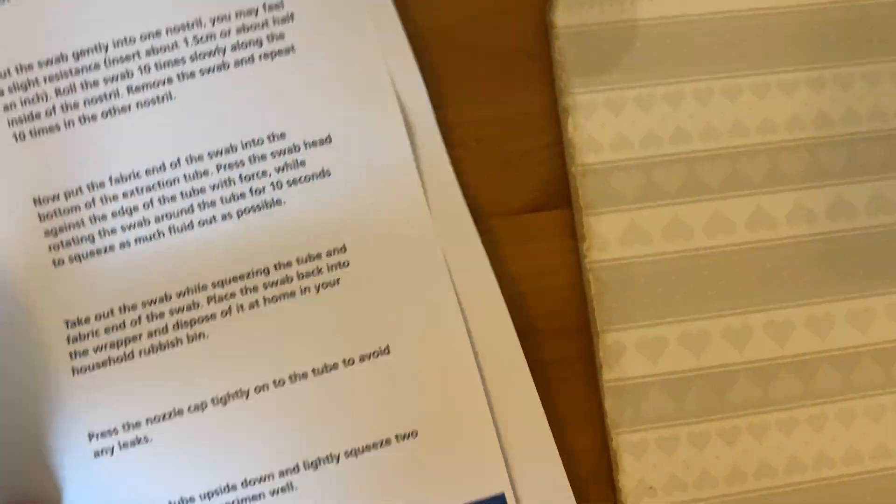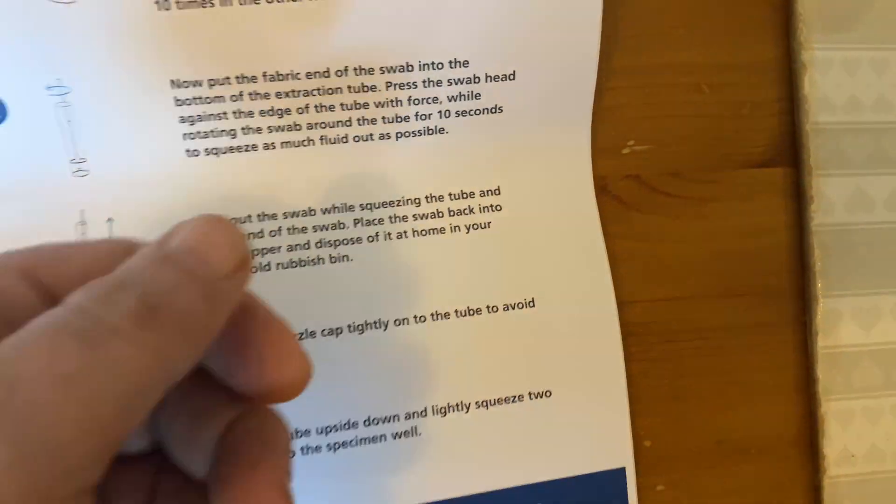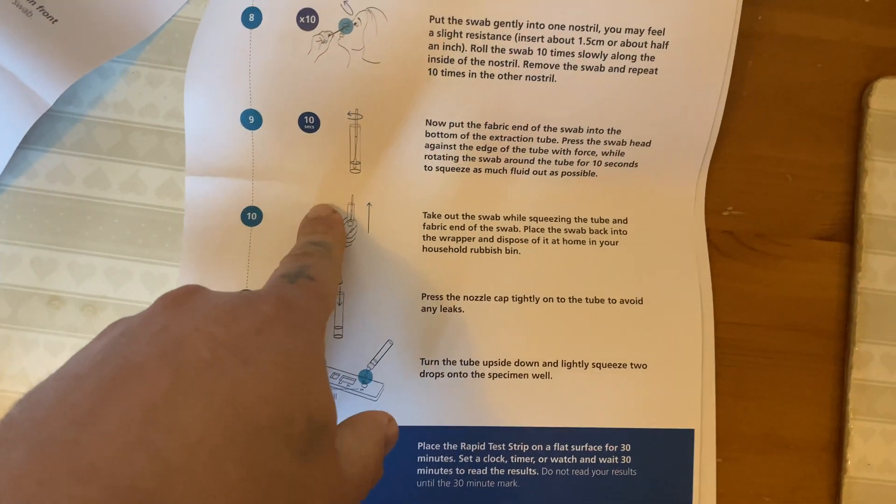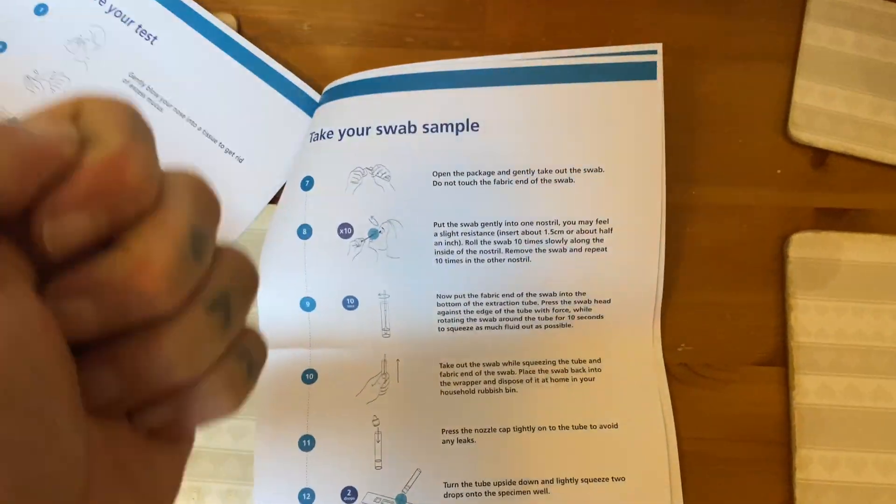The one bit I probably should have put on my original video is that they actually shake it up and down here — they're saying to put the lid on and shake it up and down, rather than just squeezing the tube and rubbing it.